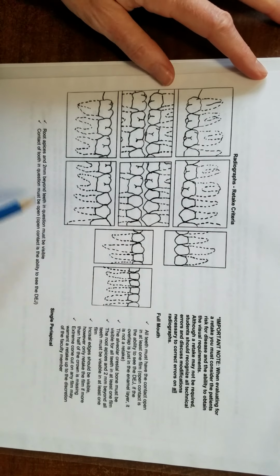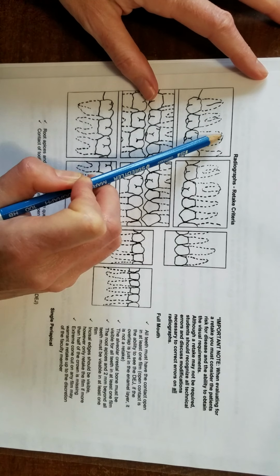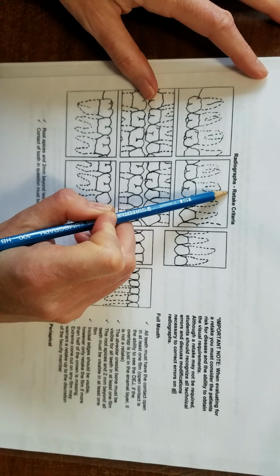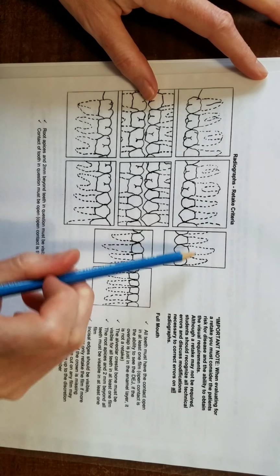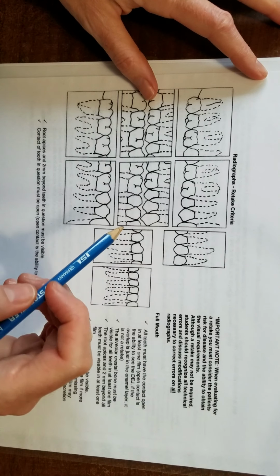So a few things to note here. Root apices: the apices of all the roots should have 2 millimeters beyond the tooth in question visible. So you want to have at least this much of the bone showing, 2 millimeters above the apices of every tooth in every picture, except for bite wings, obviously. And then the contact of the tooth in question must be open, and an open contact is the ability to see the DEJ. So you can't see it in here.